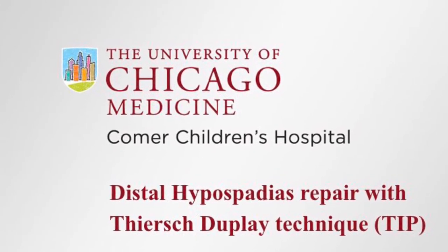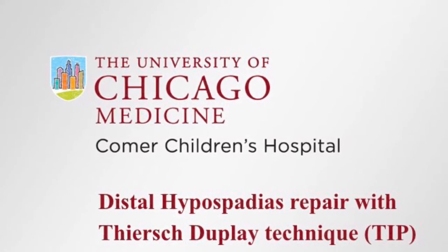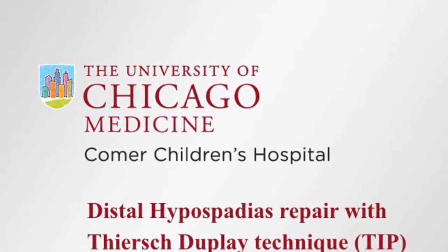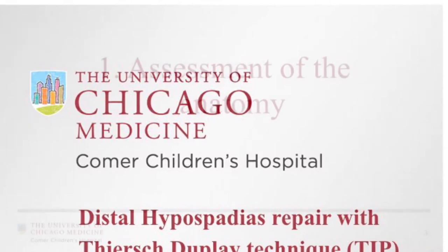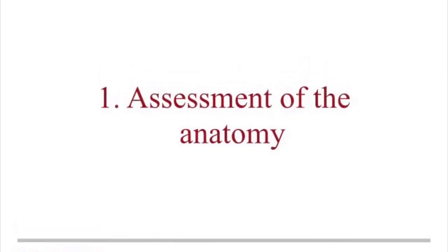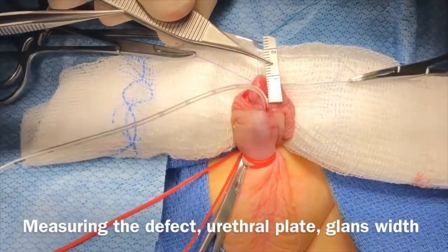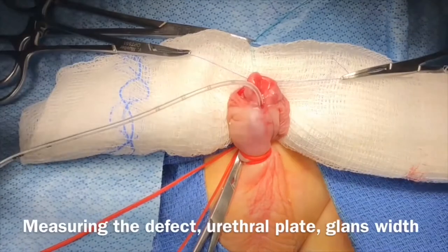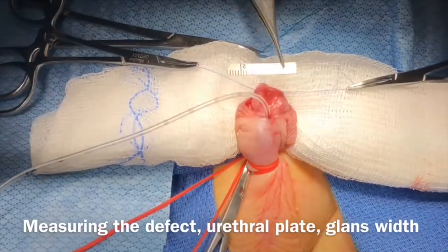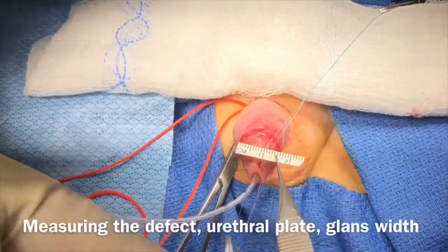We are demonstrating the technique of distal hypospadias repair with TIP (tubularized incised plate) technique. Initially, the assessment of the anatomy is very important, especially the urethral plate length, width, and depth measurement, followed by the glans width and if there is a curvature associated.